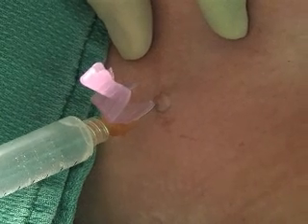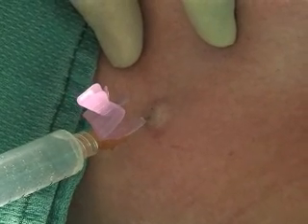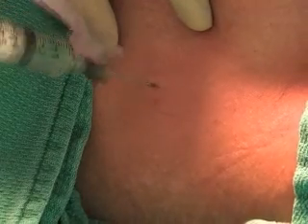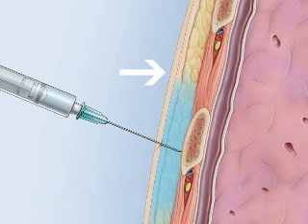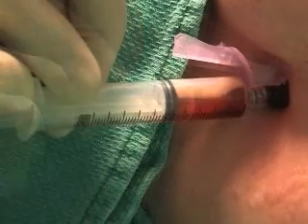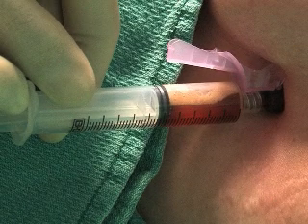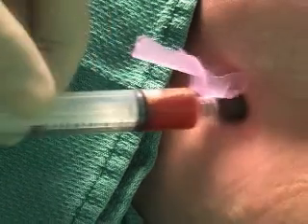Using the smallest gauge needle, create a wheal of anesthetic in the skin overlying the landmark spot. Using the larger needle, anesthetize the subcutaneous skin layers through the wheal, aspirating as the needle moves deeper. Anesthetize the periosteum of the rib below the intercostal space where the tube will be inserted. Once the parietal pleura is encountered, a flash of pleural fluid will fill the syringe if a pleural collection is being evacuated; if a pneumothorax is being drained, the syringe may only fill with air. Withdraw the needle, aspirating along the entire path.